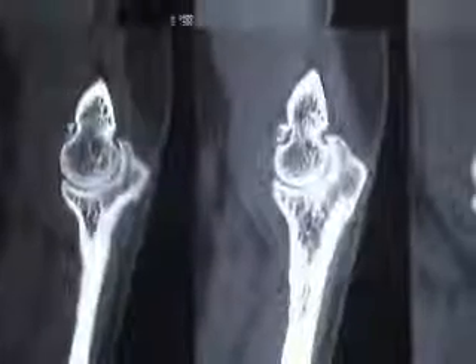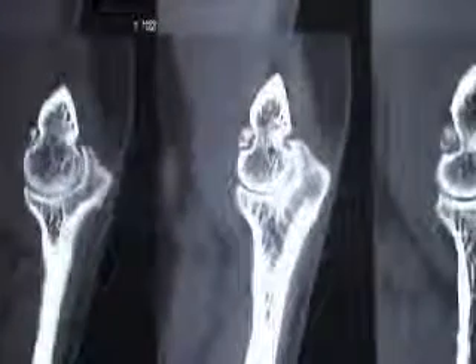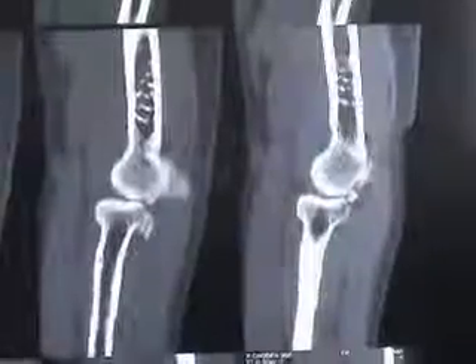On CT scan, you can see a small loose body in the anterior compartment of the elbow. The other bones looked normal. A plan of arthroscopy was made and the patient was taken up.